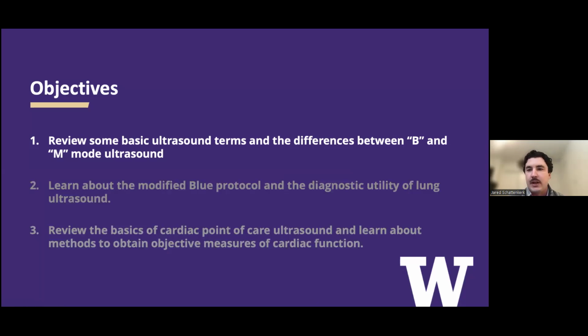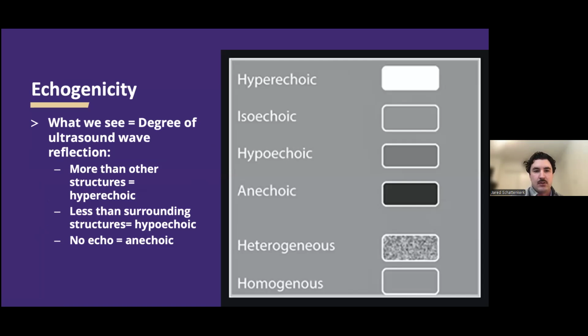So, briefly reviewing the basics, this will probably be a review for those of you who have ultrasound experience, but for those who don't, it'll be helpful in informing our discussions down the road. Firstly, just some terms that I'll use. Ultrasound is a sound wave, and essentially what we're seeing is the degree of ultrasound wave reflections from the different structures in the body.